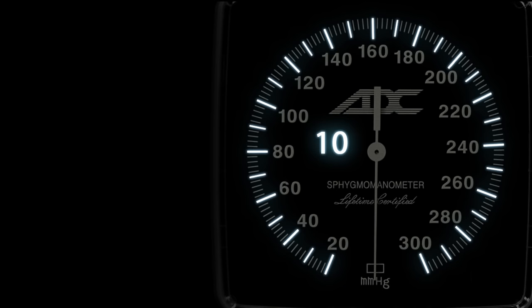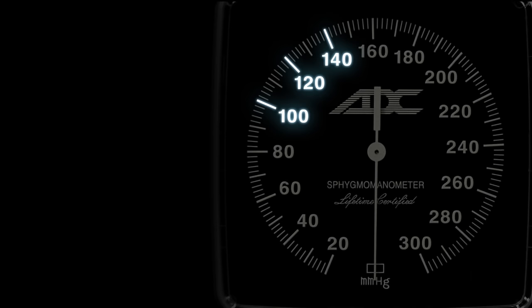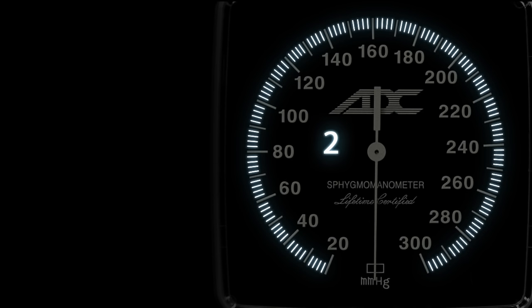There is not space on the gauge to write all the numbers. Look at where 80 is marked and where 100 is marked. The long line in between indicates 90. You can see that the numbers 100, 120, 140 are written on the gauge. The unnumbered long lines indicate 110, 130, 150 between the marked numbers. The short lines all equal 2.